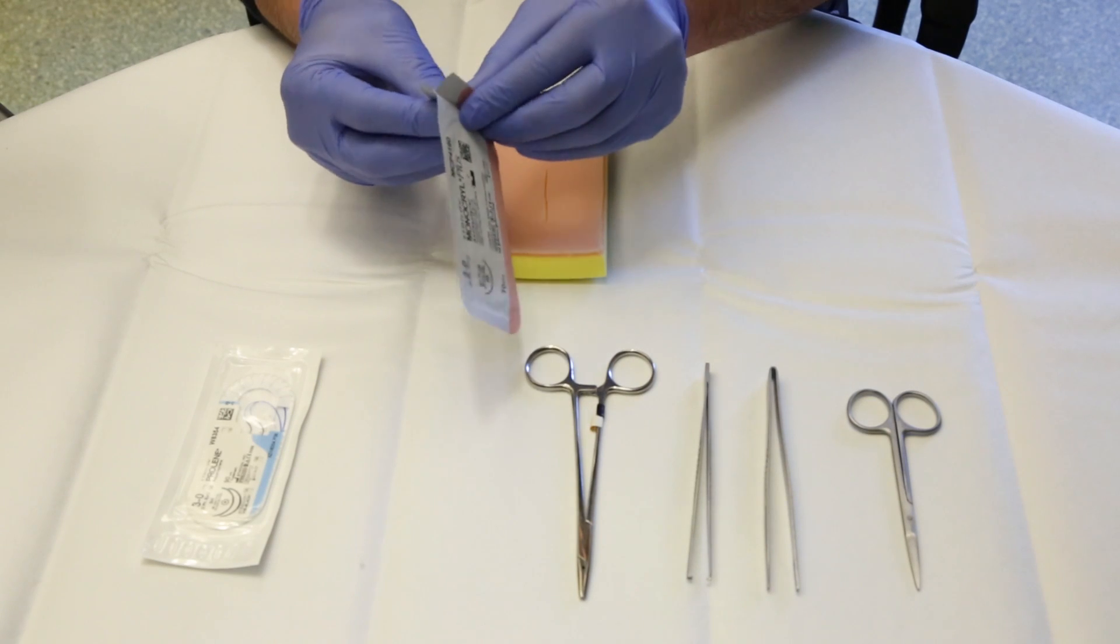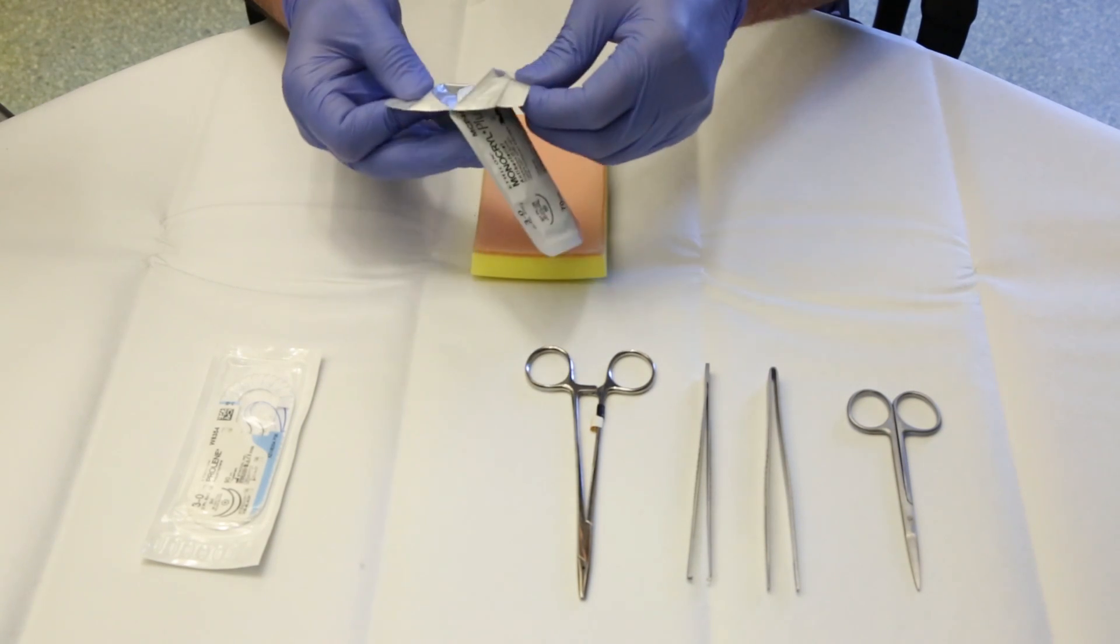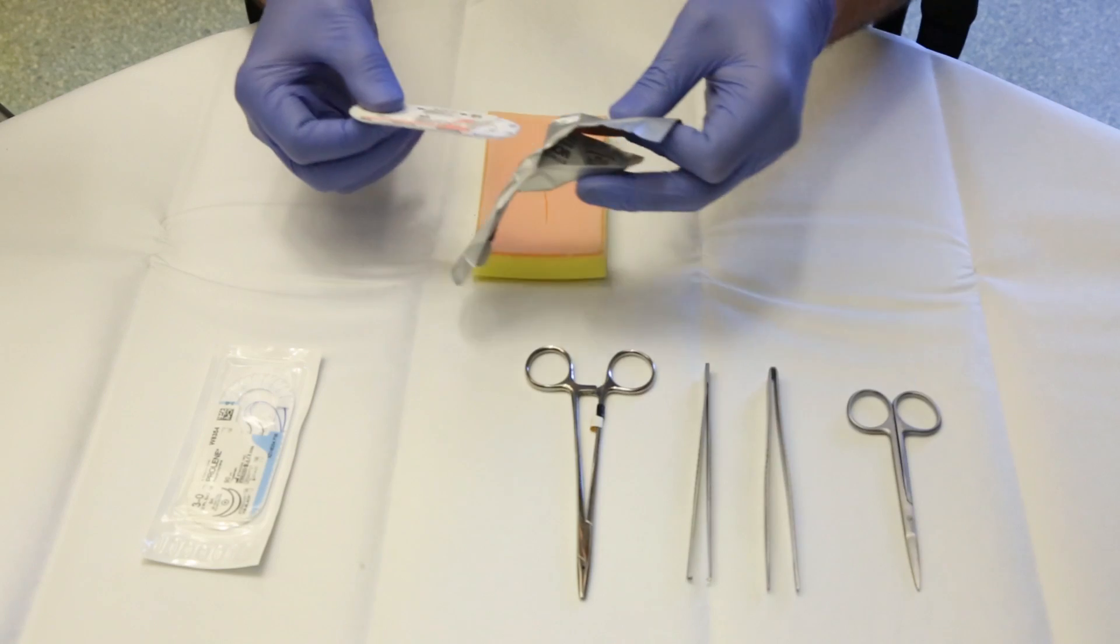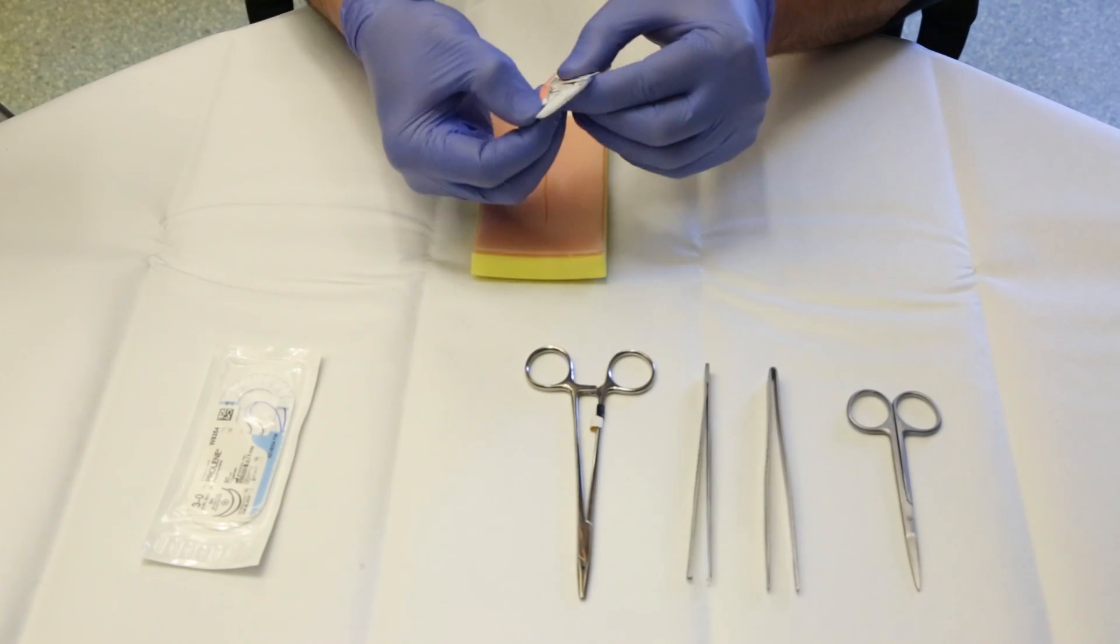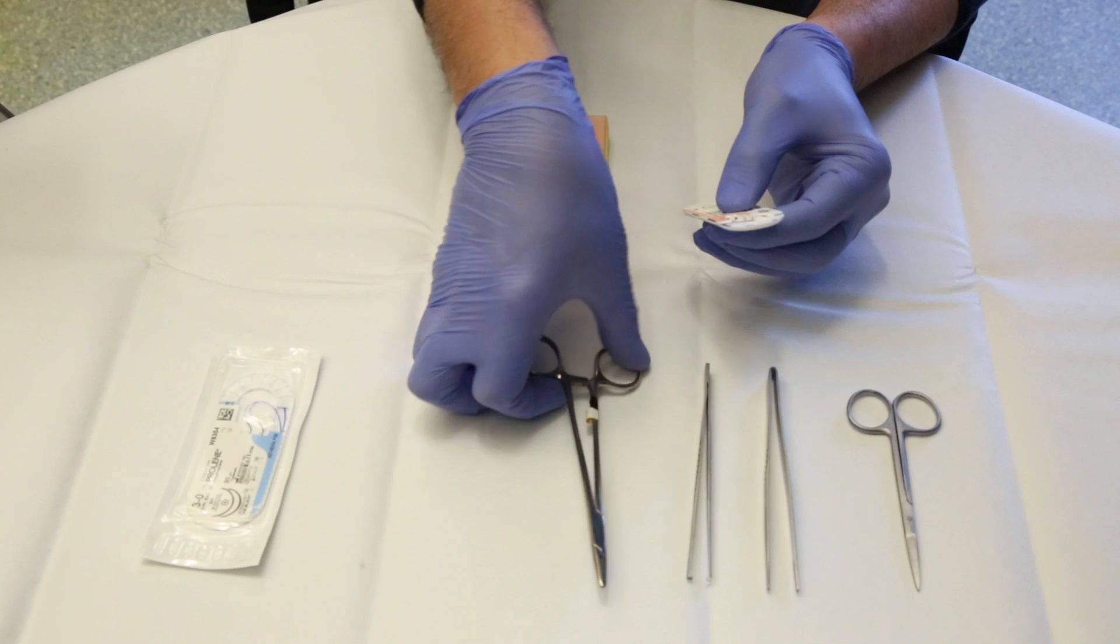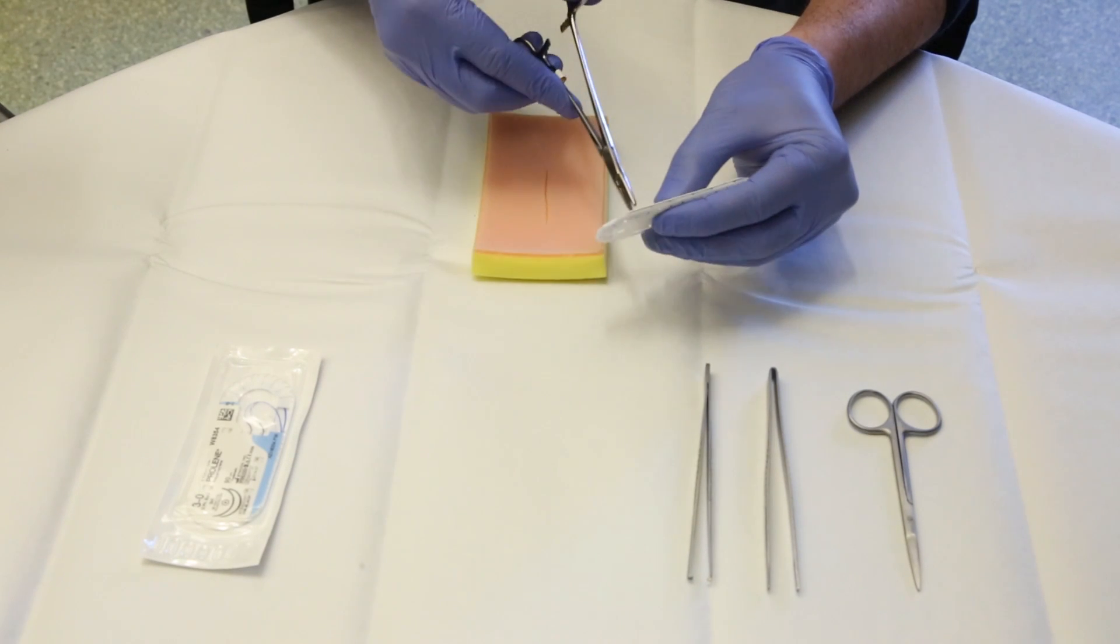So the first step is to get our stitch out of the package and we'll reveal the needle out here and then take it with the needle holder.